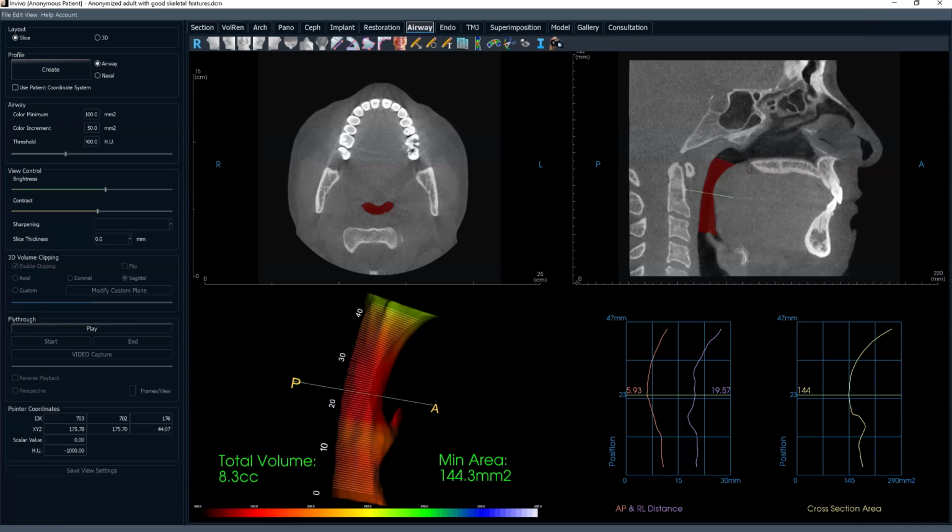Beautiful. Thank you so much. And circling back to the last question, Dr. Adair, we had: what percentage of the time do you find vertical root fractures? Oh, that's a great question. Thank you for that clarification. I should have probably figured that one out. Not very often. No one wants to hear this, but the reality is commonly the point at which you can see it radiographically, you can see it clinically. If someone submits a small field of view, maybe just of a quadrant in high resolution, you can see vertical root fractures.